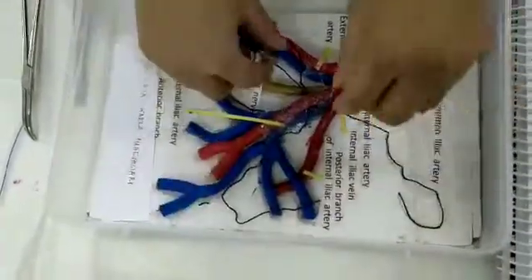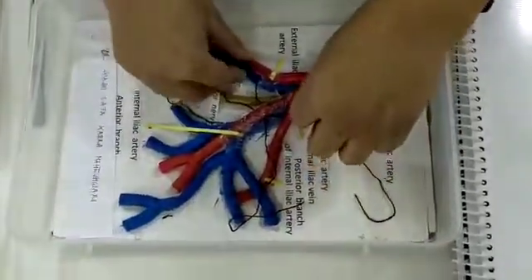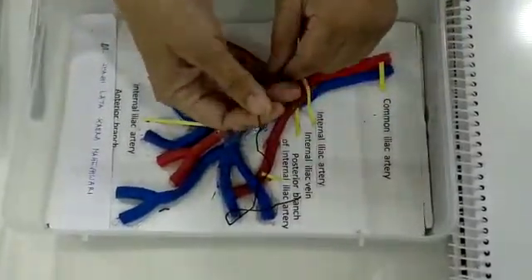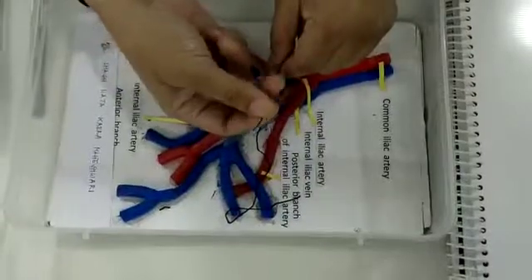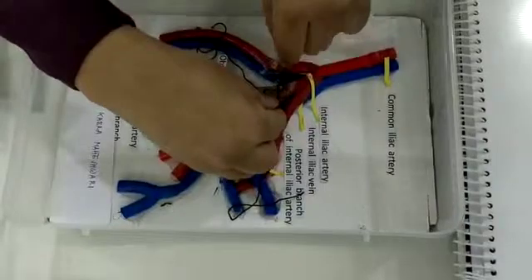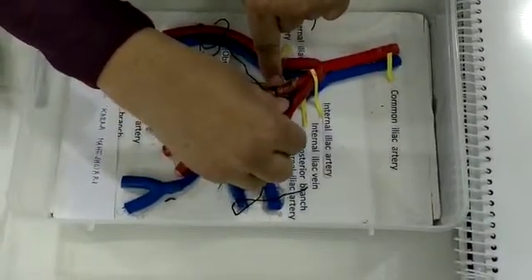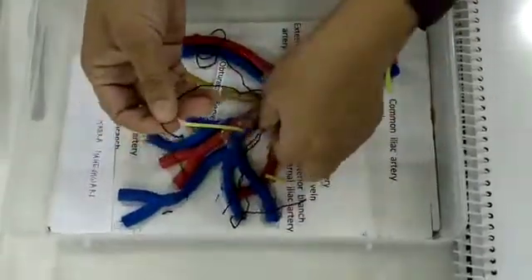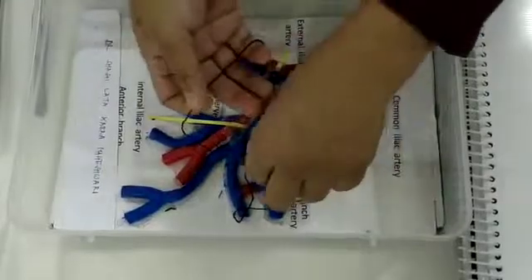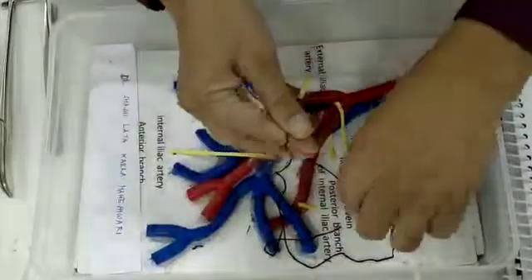Now you can see that we have two different threads. These are to be ligated at a distance of 0.5 centimeters. I take two turns, and then I'm going below, respecting the artery, going up to the top of the artery with my fingers, and supporting the artery like this. Second knot, third knot.